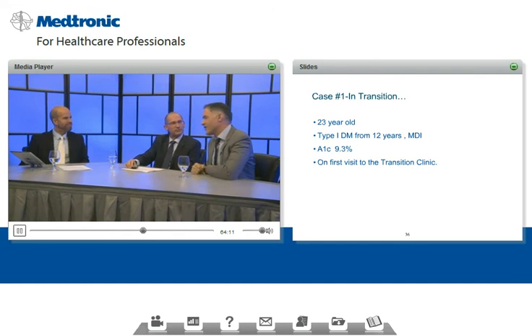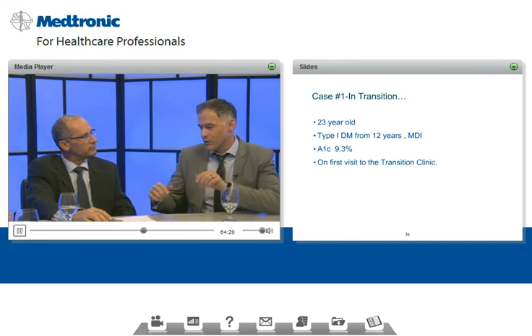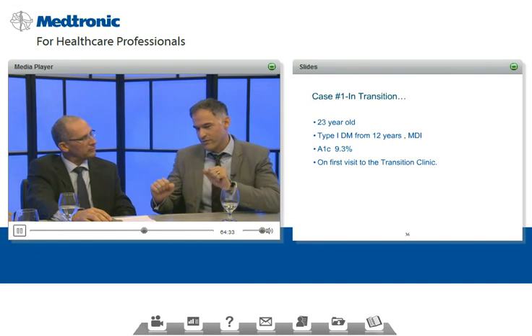Go ahead. You know, I think that's so sophisticated how you took things step by step. Basal, food bolus, correction bolus. But there's so many situations where, for example, that patient who had, I think, too much food bolus in the afternoon, they were getting low, and you might adjust up their carb ratio so that they're not going low later in the afternoon.